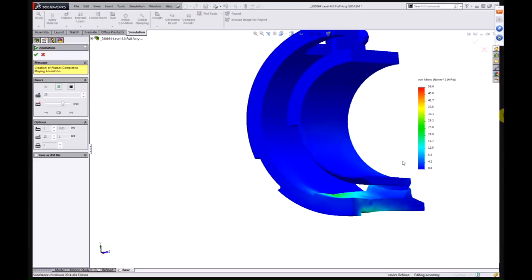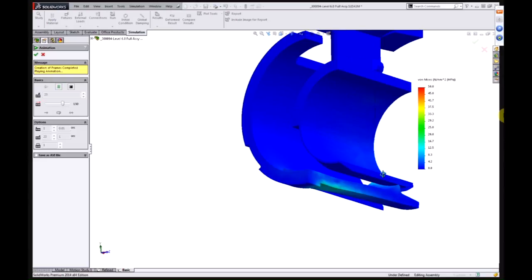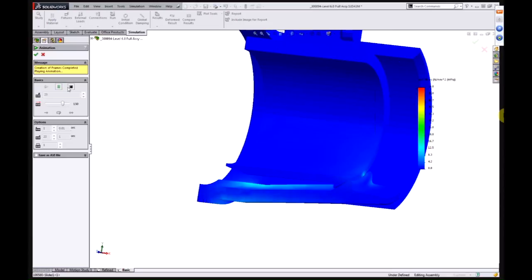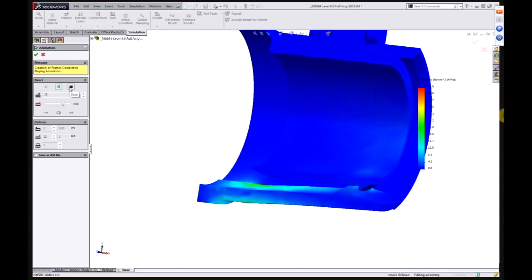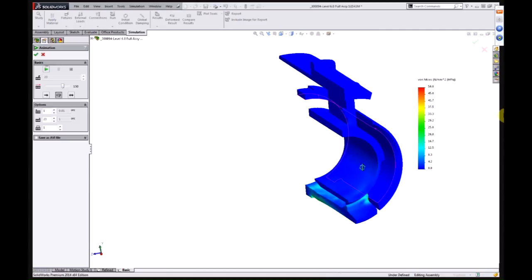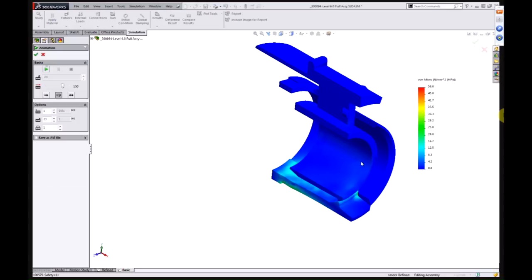There we go. So, it's an example. It is a nonlinear example, but it uses linear material models. If we didn't have as much movement, we could apply loads and forces to this and solve this problem with either SOLIDWORKS Premium or SOLIDWORKS Simulation Professional. And what I've done here uses SOLIDWORKS Simulation Premium.